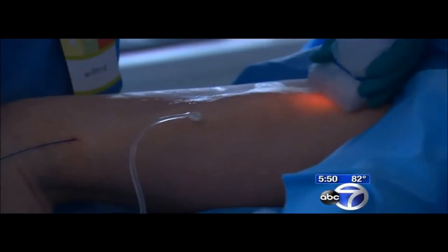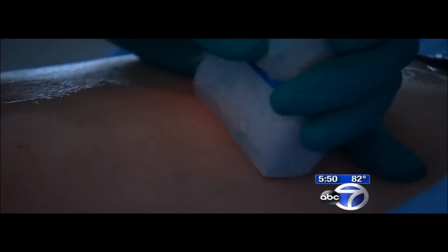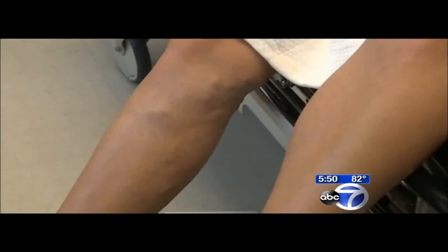Do you have any pain at all? No, not at all. No pain, as a red laser moves under the skin of Corinne Logan's leg. Her varicose veins have been embarrassing. "I cover them up and I haven't had shorts in seven years. They're just unsightly and I'm just excited to be able to get rid of them."